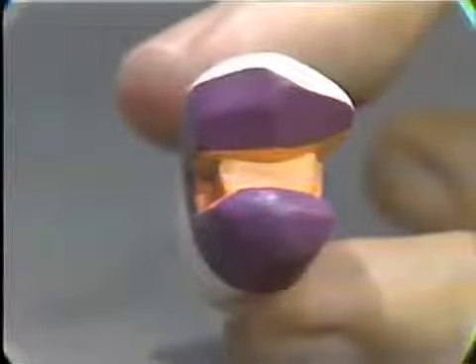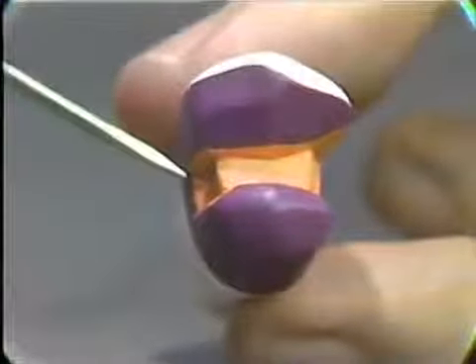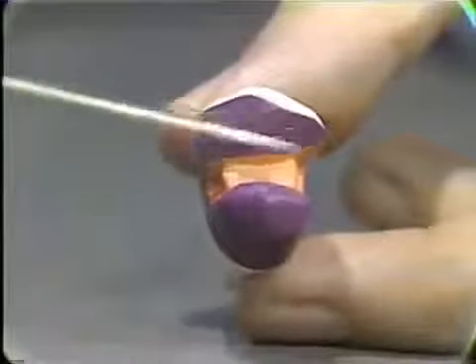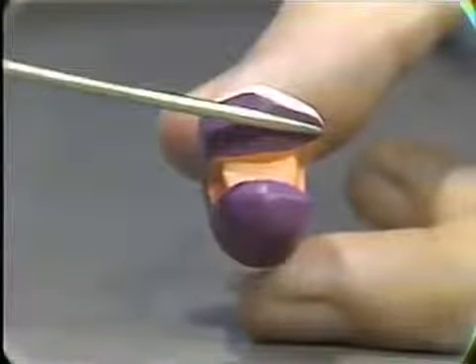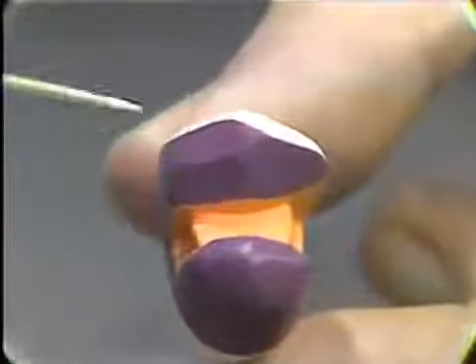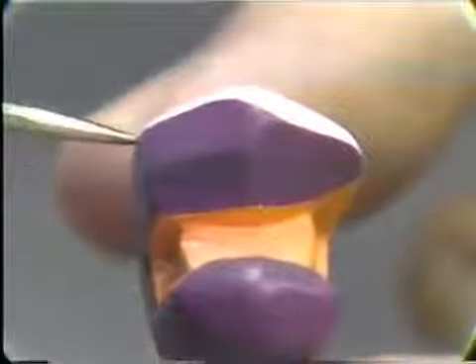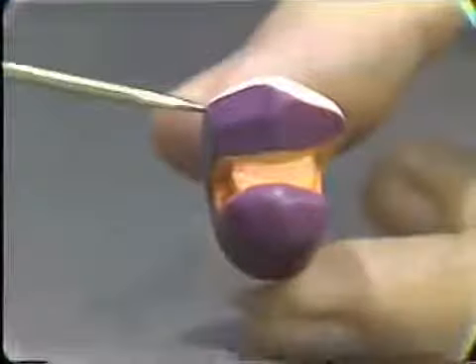This particular preparation shows a combination of both the slice on this surface here and of the box type of finish on the mesial here. Now this is a maxillary bicuspid tooth, and the box preparation is done on the mesial because it gives greater control over the extent of gold showing on the mesial surface here. I think you can see, comparing the position of the boundary on the buccal surface there with the one on the distal where the slice is here, that it's considerably more conservative in extension on the mesial than it is on the distal. Where you do a slice, it's necessary, of course, to go this far out in order to get removal of the external undercuts of the tooth, which is so essential.